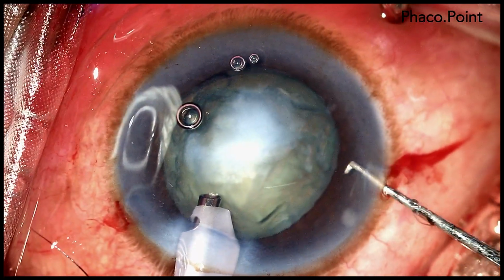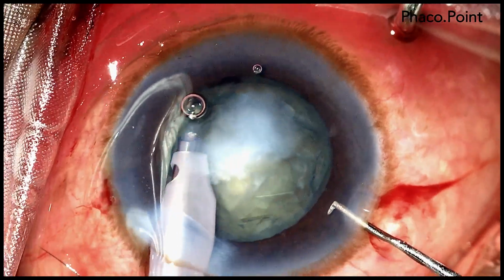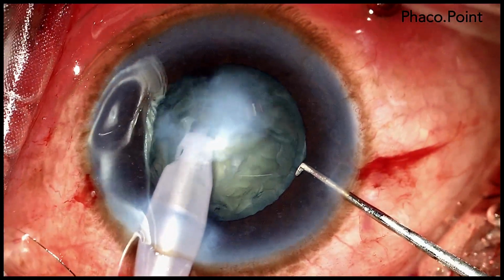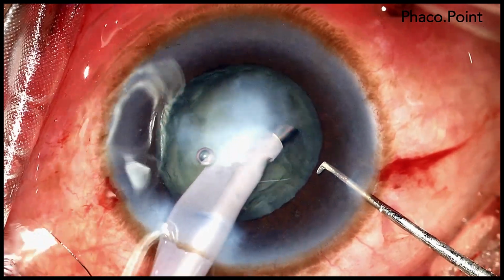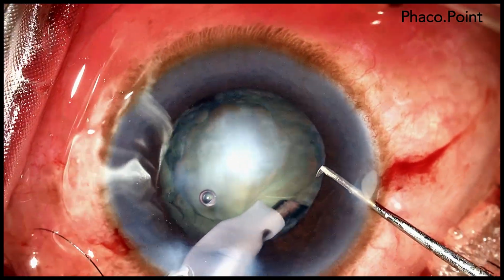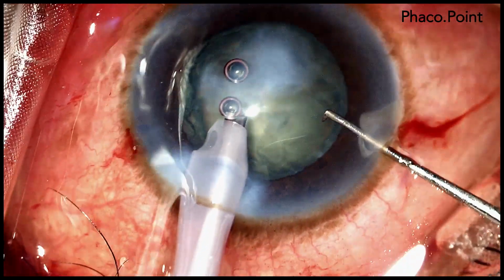The second instrument, which is a short chopper, is introduced through the paracentesis incision, and watch how all the superficial cortex, which could obscure further the visibility of the anterior surface of the nucleus, is aspirated. Having aspirated the cortex, I am now ready to perform the direct chop.